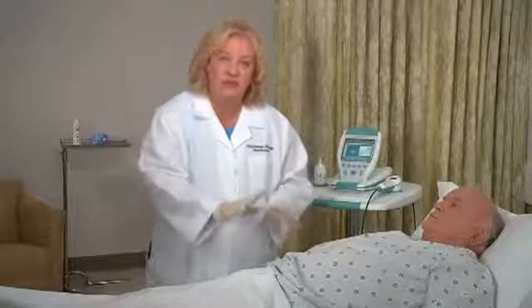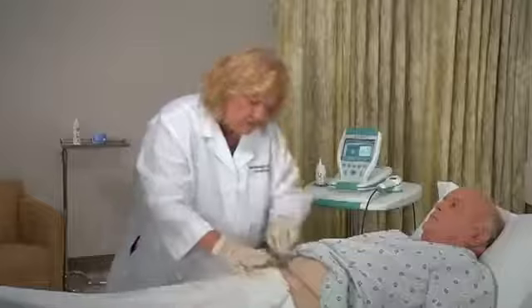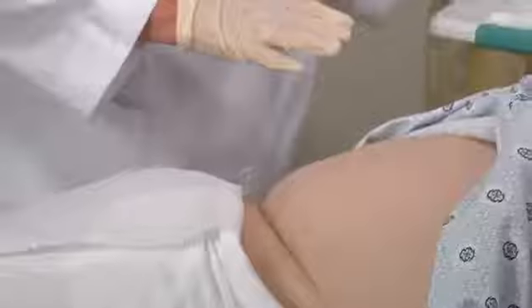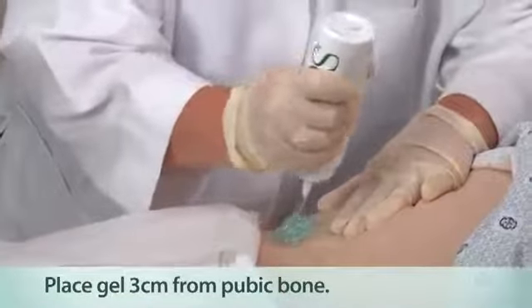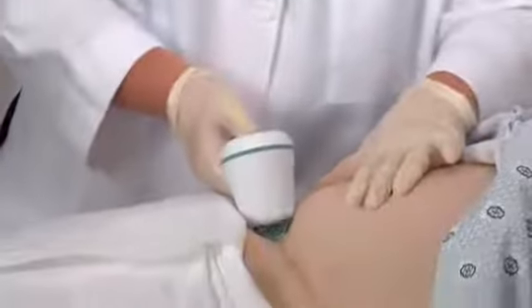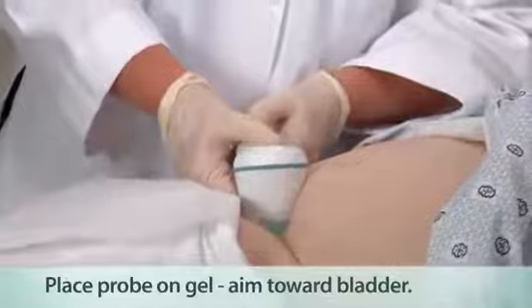Before you do the scan, you want to really visualize the area that you're going to scan. You want to locate the pubic bone because you're going to scan above it, so palpate that area. Next, place a generous quantity of gel midline on the patient's lower abdomen, about one inch or three centimeters above the pubic bone — a generous amount ensures a more accurate scan. Standing alongside the patient's right side, place the probe on the gel and aim it downward behind the pubic bone towards the expected location of the bladder.